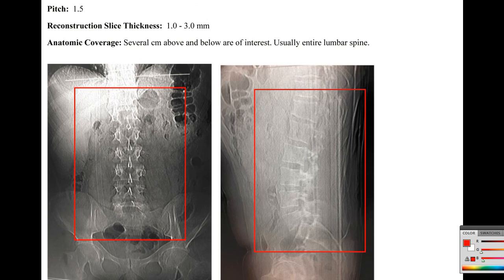However, in terms of the lumbar spine, it's essential to include all of the lumbar spine. So this usually means T12 to S1 or S2. And when we're saying S1, we're talking about the levels of the sacrum. However, I like to go probably about midway through the sacrum so that you can verify that you're getting all of this area. Usually both sagittals and coronals are useful in planning this image out.